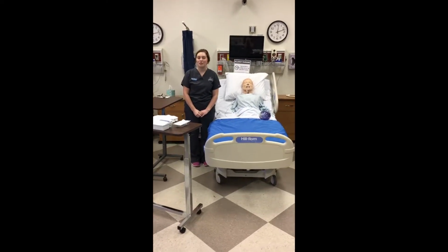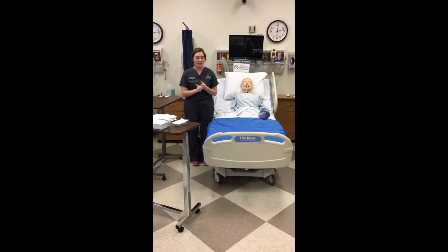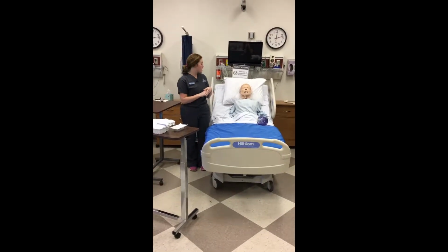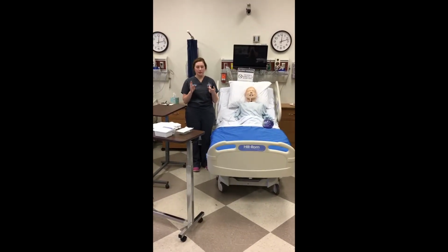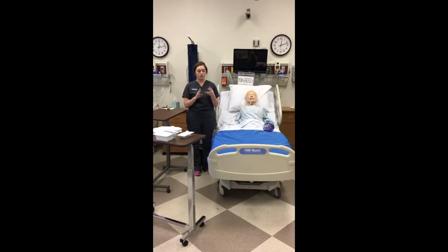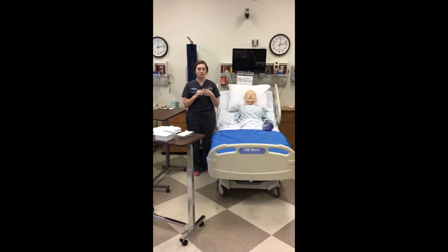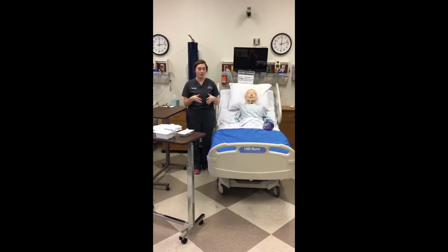My name is Mackenzie and I'm going to be showing you how to do oral suctioning and oropharyngeal suctioning today. So first, you're going to want to go into your patient's room. You're going to want to assess them. If any gurgling is present, decreased respirations, or a decreased O2 stat, those are good indicators for your patient's need of suctioning.